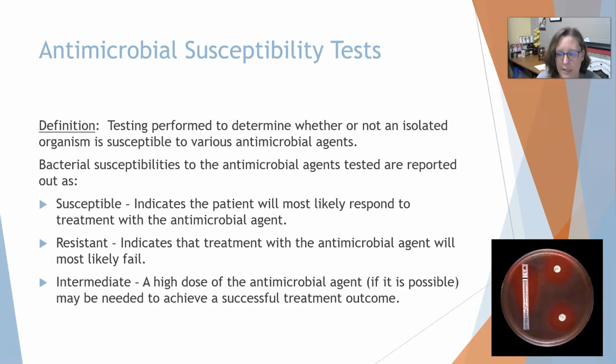And so this can also help identify microorganisms such as MRSA, that is methicillin-resistant Staph aureus. You can identify Staph aureus with the biochemical testing, but the antimicrobial susceptibility test then allows you to tell that it's not just regular Staph, it's actually MRSA. So that can also key into identification.